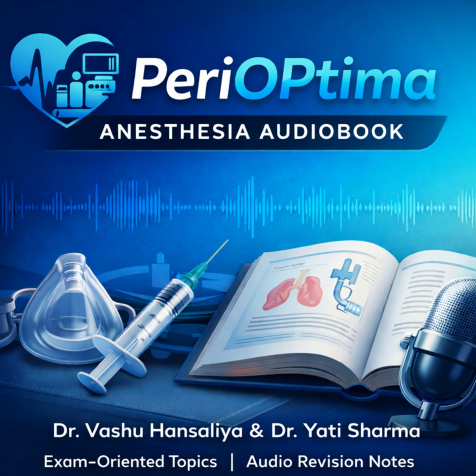Right. Now, let's talk about pulse oximetry. This is a favorite short note topic. It's SpO2. It works on the Beer-Lambert law. It uses two wavelengths of light, 660 nanometer, which is red, and 940 nanometer, infrared, to distinguish oxygenated from deoxygenated hemoglobin based on their absorption spectra. That's the physics, and you need to write that down. But what's the clinical trap?